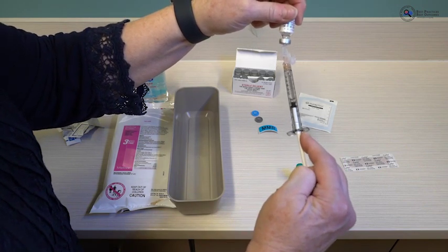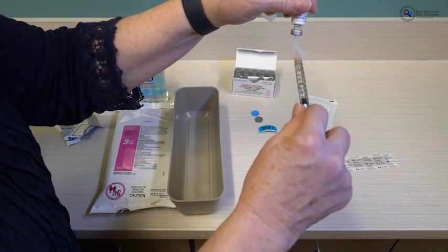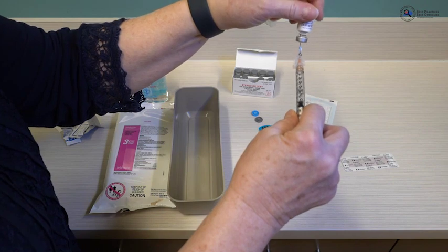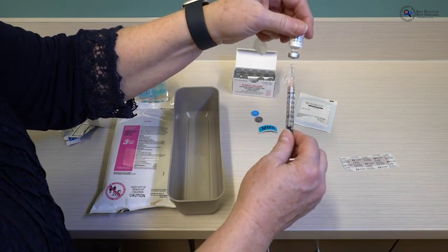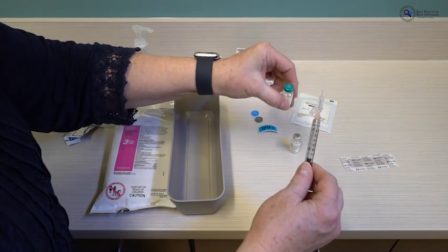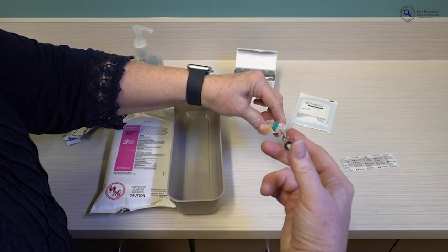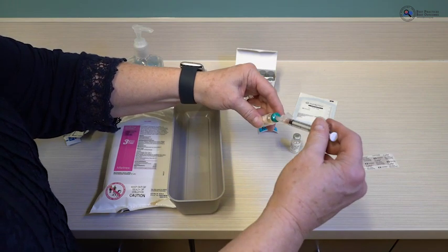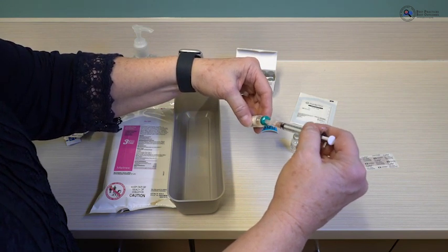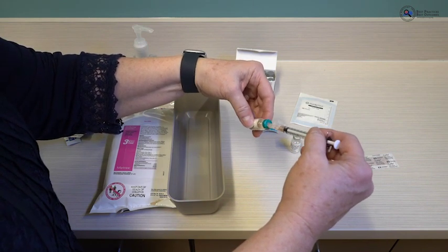Keep controlled in your movement and inject any air back into the vial until you get out the diluent. Most diluent vials will contain about 0.5 to 0.7 cc's. Set the diluent vial aside — you do not change your needle — keeping the needle well away from anything else. Inject the diluent into the vaccine vial, leave your needle and syringe in, and gently swirl. It takes about 20 seconds for the vaccine to dissolve into the diluent. Keep it moving gently with your fingers well away.